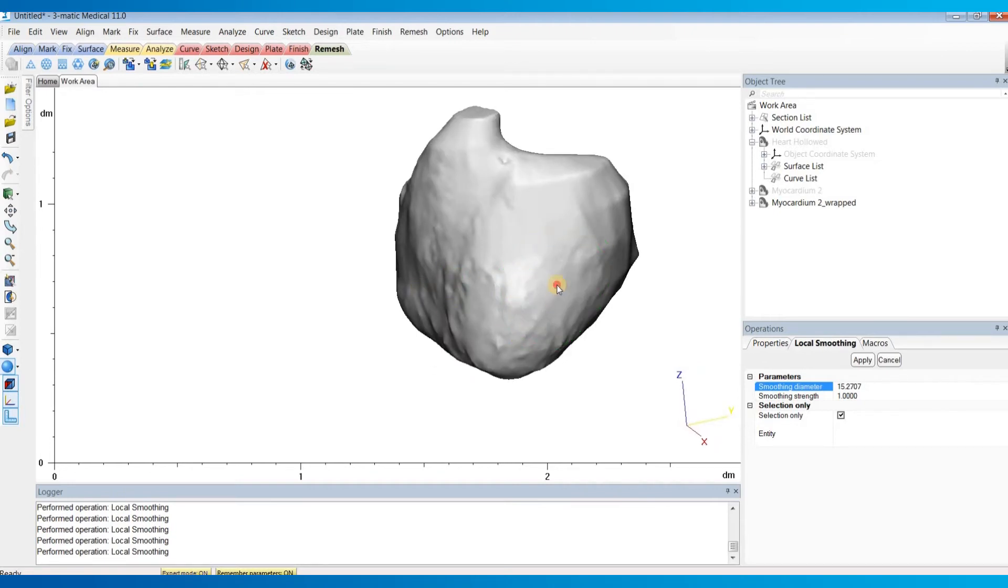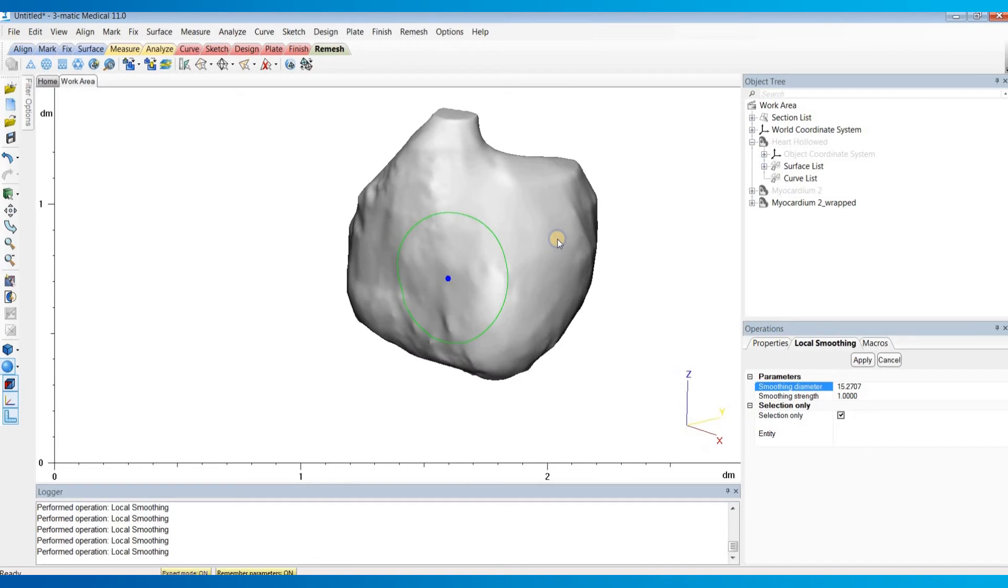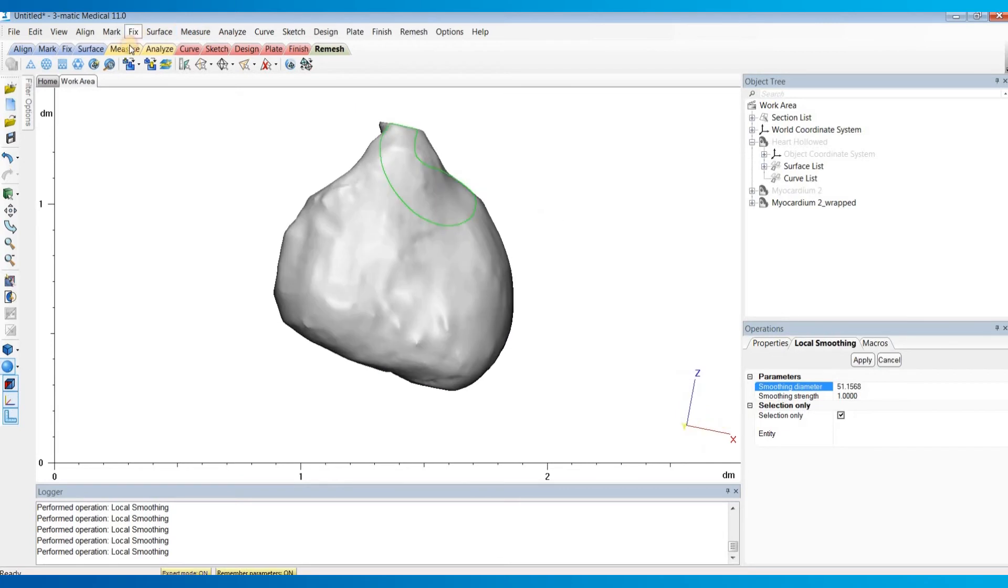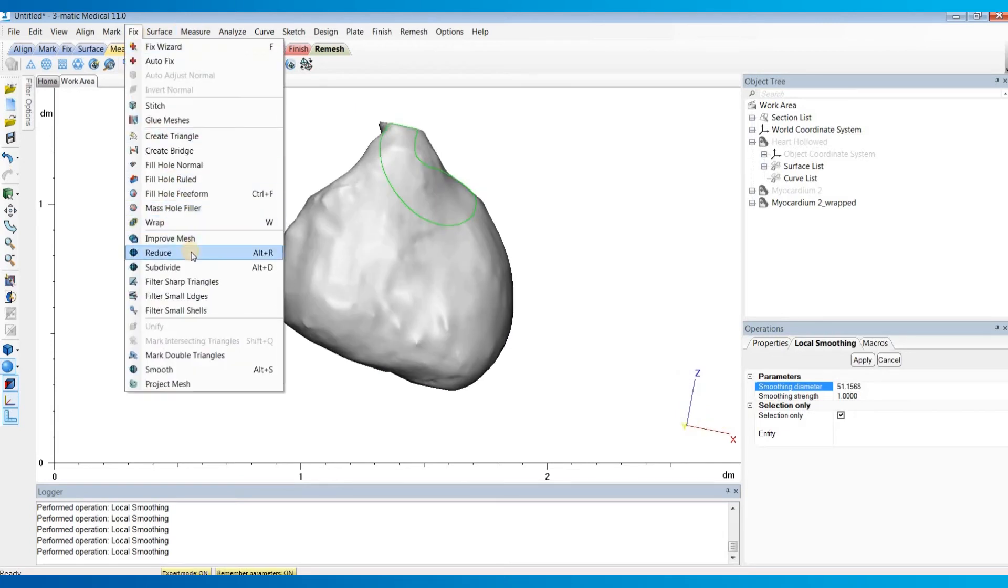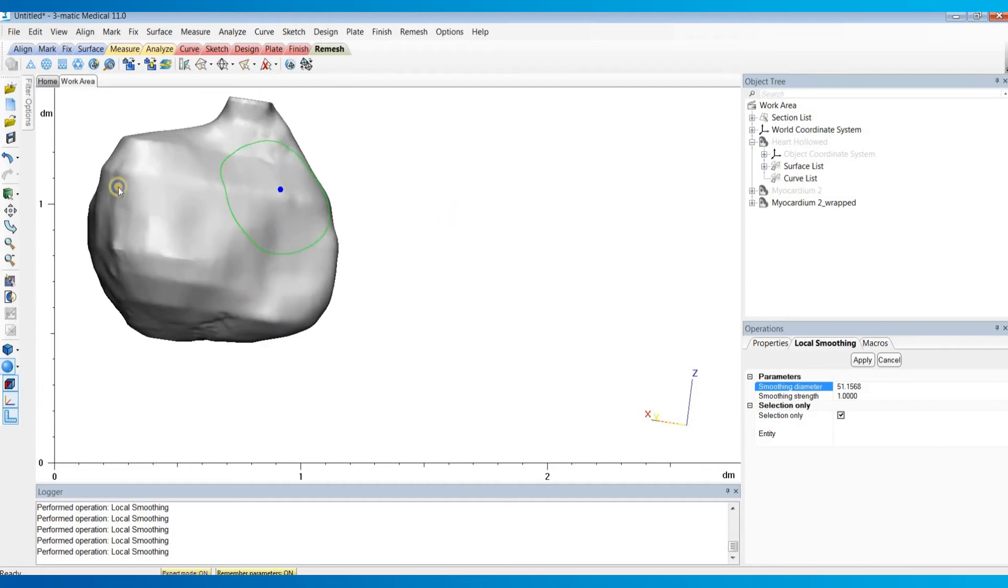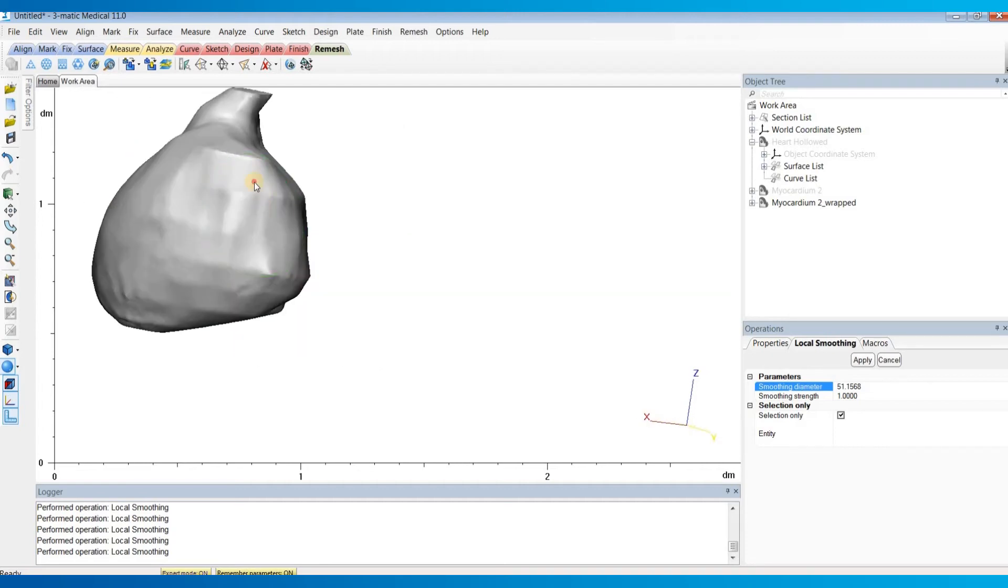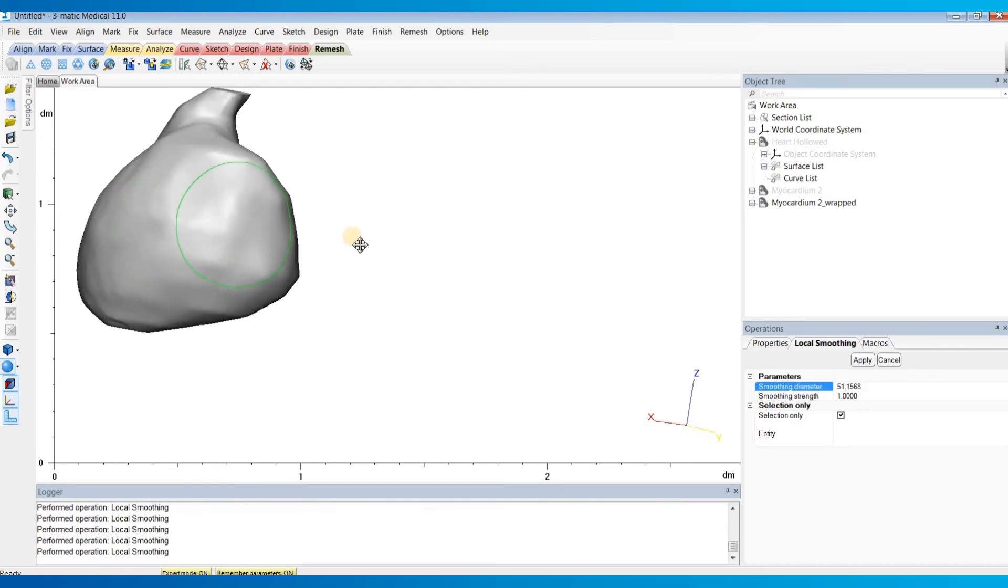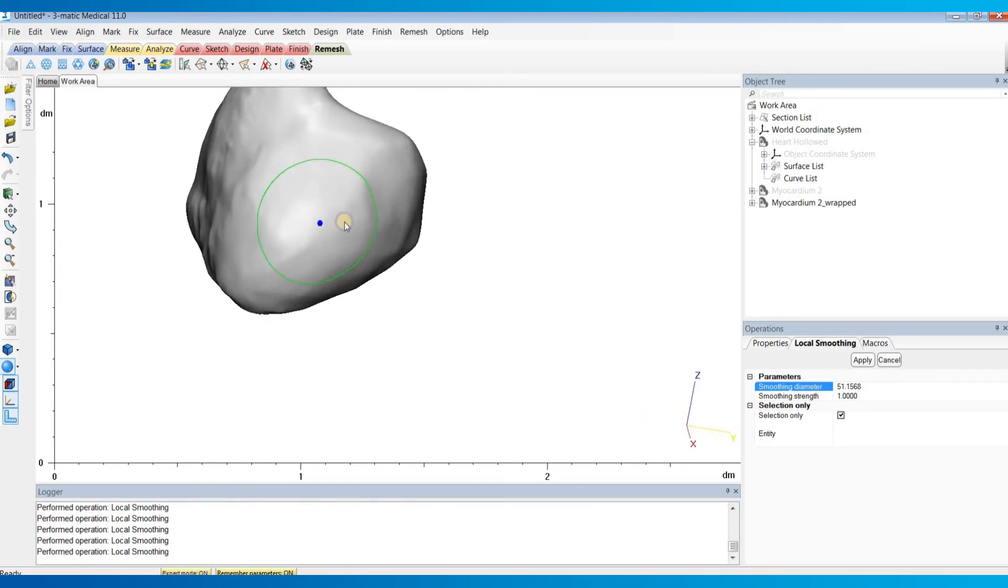If you'd like, you can also under the fixed menu do a reduce operation. If the local smoothing doesn't seem like it's being very effective or smoothing very much, reducing the number of triangles can increase the amount that this tool smooths.